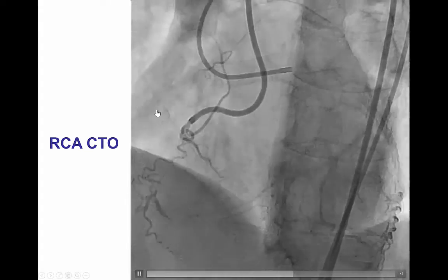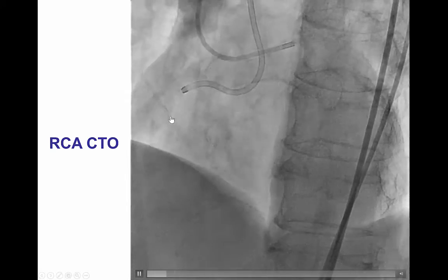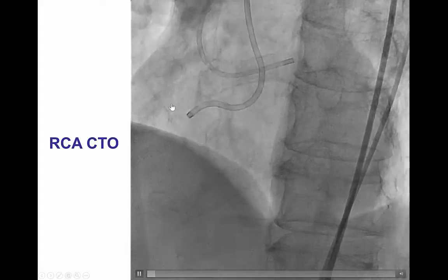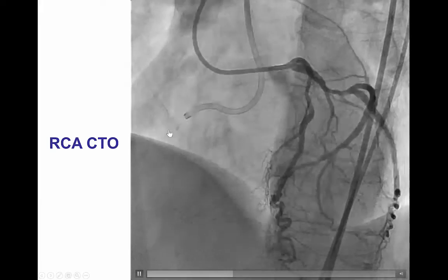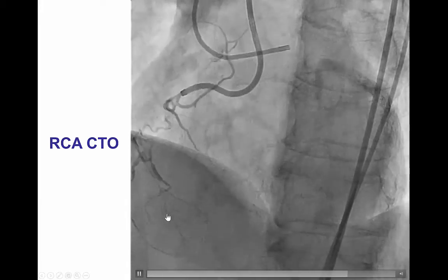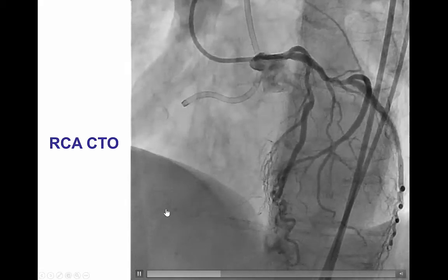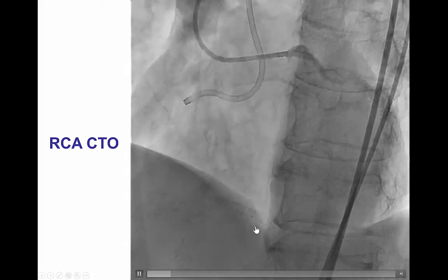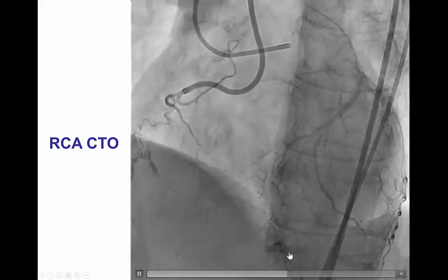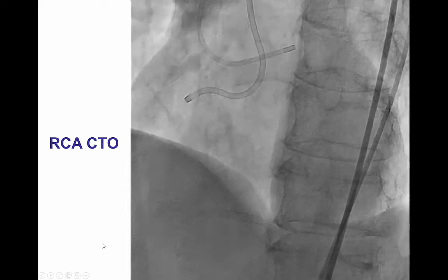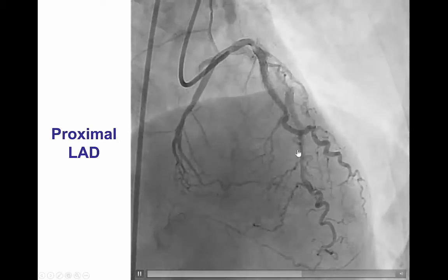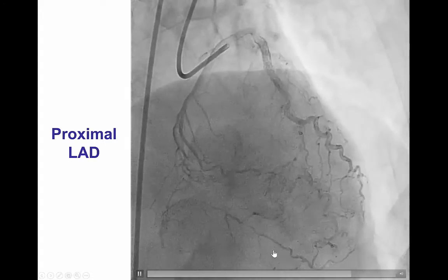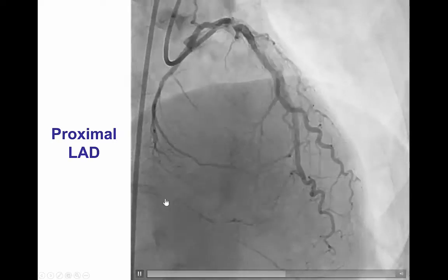Diagnostic angiography demonstrates occlusion of the proximal right coronary artery with multiple branches originating at the proximal cap, making it very hard to determine the origin of the vessel. It's a long area of occlusion, with some reconstitution of the mid-RCA from bridging collaterals, and in the distal part of the vessel there was a previously placed stent. The PDA was filling via collaterals from the LAD, seen in the RAO cranial view, showing septal collaterals supplying the diffusely diseased posterior descending artery immediately distal to the previously placed occluded stent.